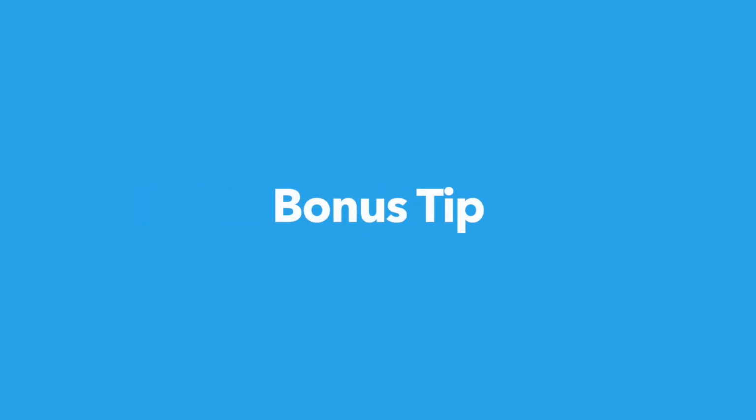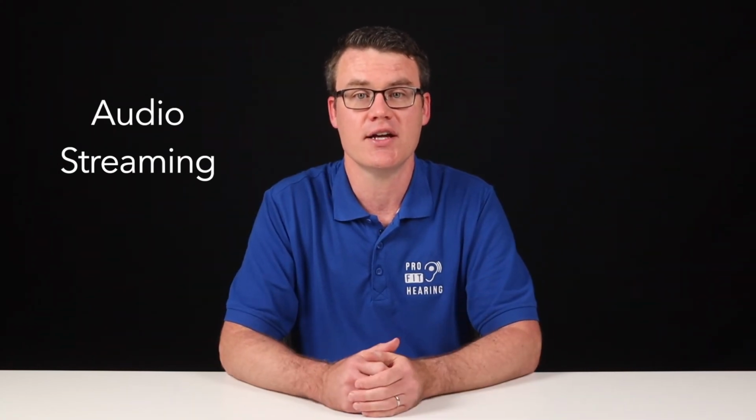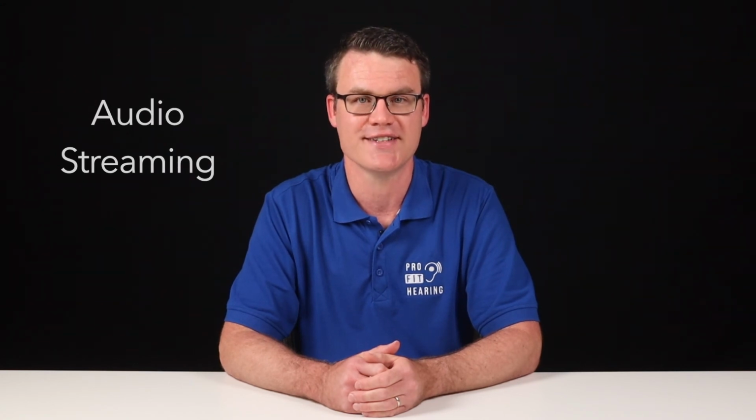Bonus tip. Okay, so let's talk about the bonus tip for optimal music sound quality for hearing aid users. Use audio streaming. Hearing aids today often connect directly to smartphones and have wireless accessories so that you can connect your hearing aids directly to a music playback device. This technology allows you to listen to music without using separate headphones or earbuds. Another benefit of using audio streaming for hearing aids is that the music sound quality is customized to your degree of hearing loss. This way you can have the best listening experience.